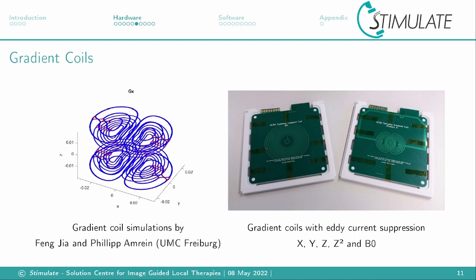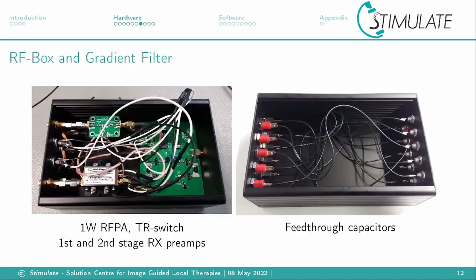To the original coils for XYZ and the shim Z2, a B0 coil was added. This allows for compensating the temperature-dependent field drift of the permanent magnet. Inside the magnet box there are two additional shielded housings, which contain the RF chain and the gradient filters. The RF chain contains a 1 watt RF amplifier, the transmit-receive switch, and first and second stage low noise preamplifiers for the received spin signal.